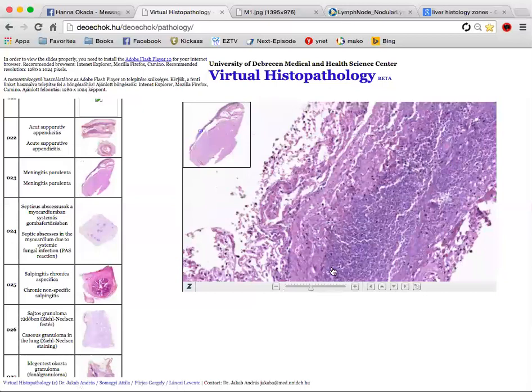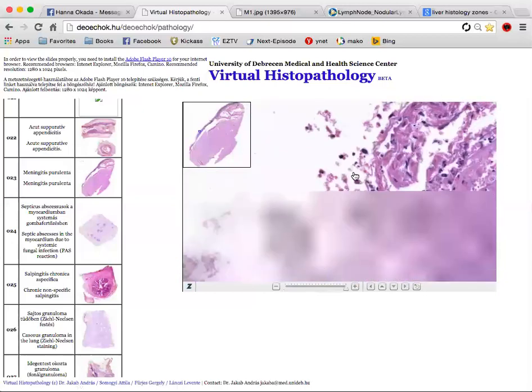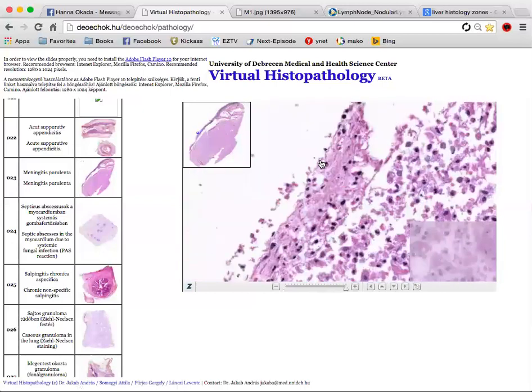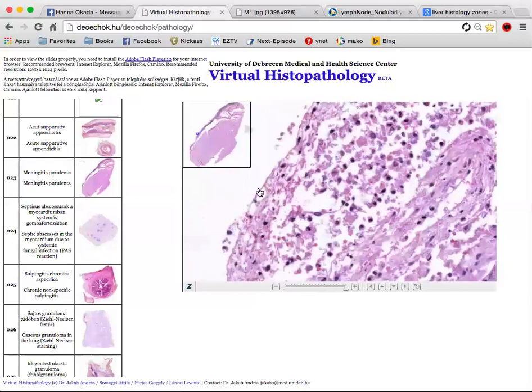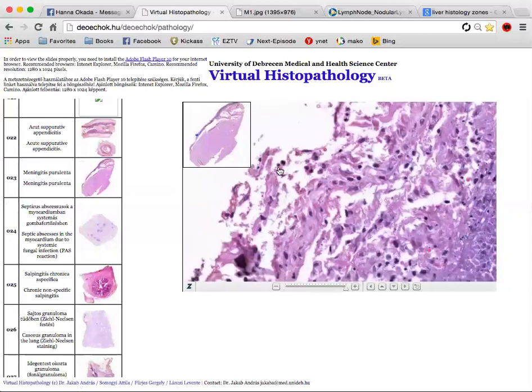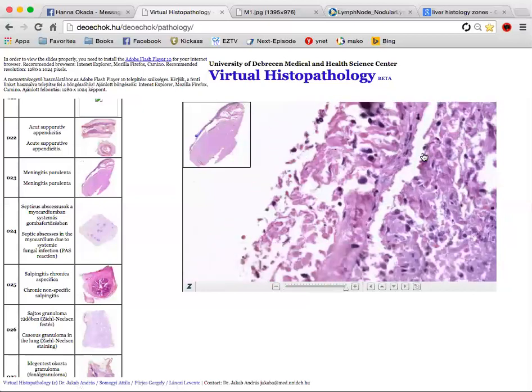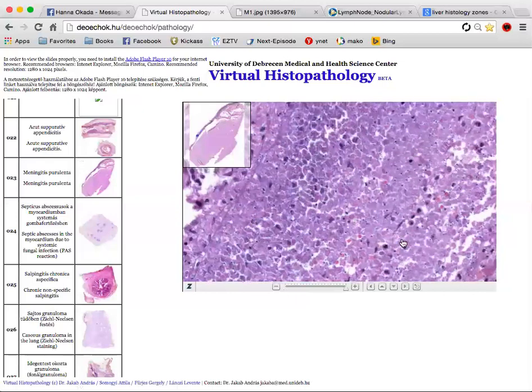And this is pus. We're going to talk about it in a second, because I want to go to where I can maybe see some remnants of the arachnoid layer. It's just remnants. You're not going to see a nice layer because it's pretty much destroyed here. So I'm going to go over to this area, and this is again pus.